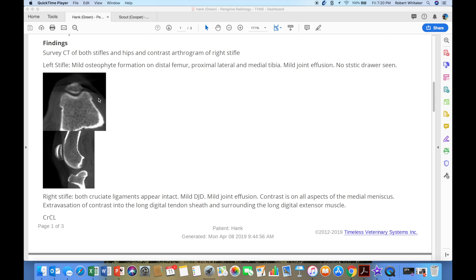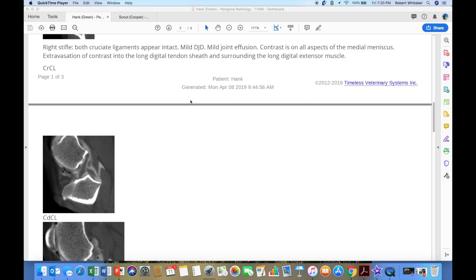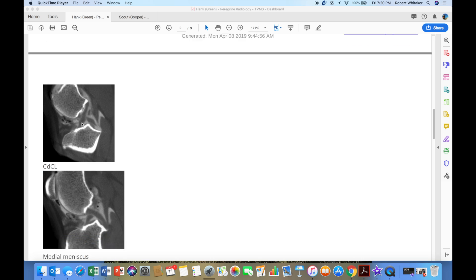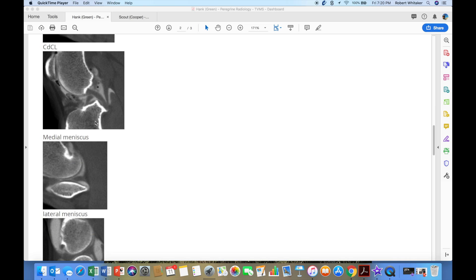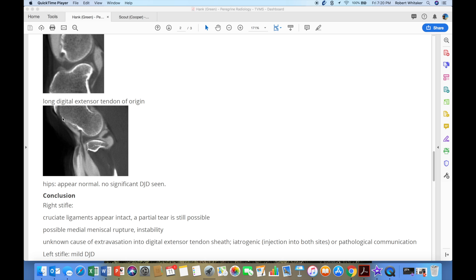Mild osteophyte formation on distal femur — these right here are images of the distal femur. Right stifle: both cruciate ligaments appear intact. Mild degenerative joint disease. Contrast is on all aspects. Extravasation of contrast into the long digital tendon sheath and surrounding the long digital extensor muscle — that's a concern to them. The report labels the cranial cruciate ligament here, the caudal cruciate running down through here, and both medial and lateral meniscus on display. The long digital extensor that he speaks of is right through here.